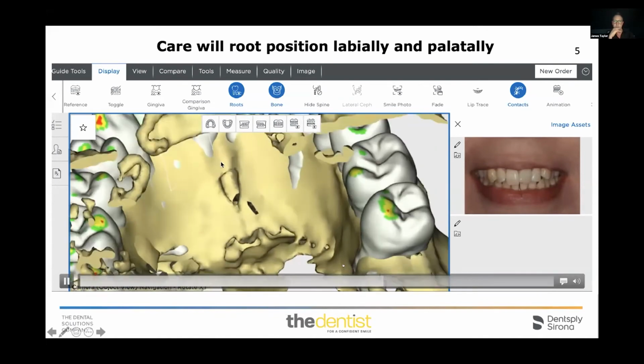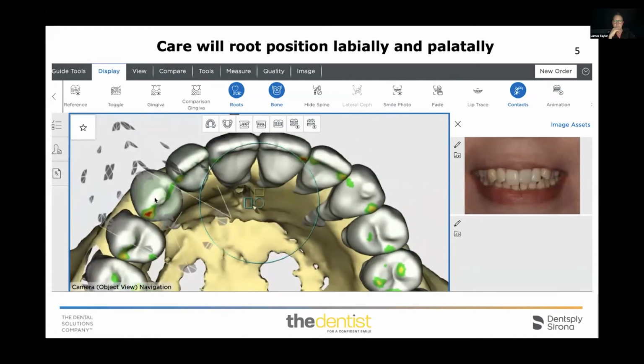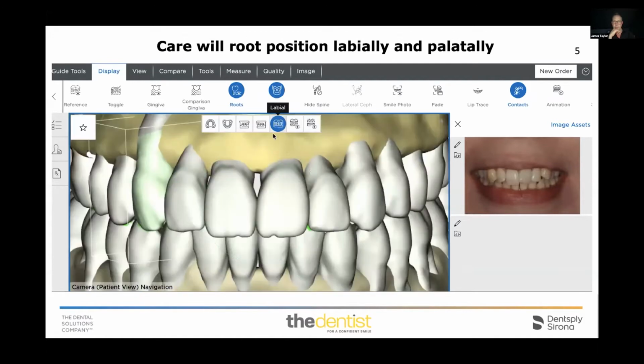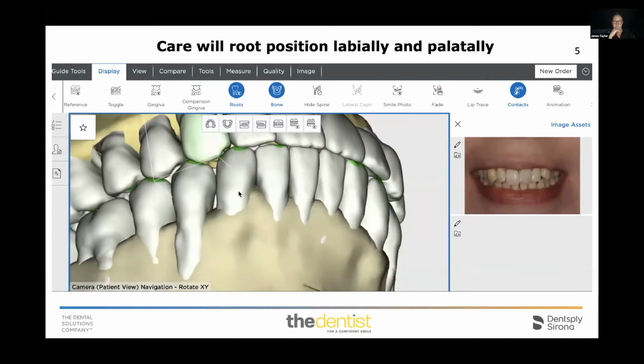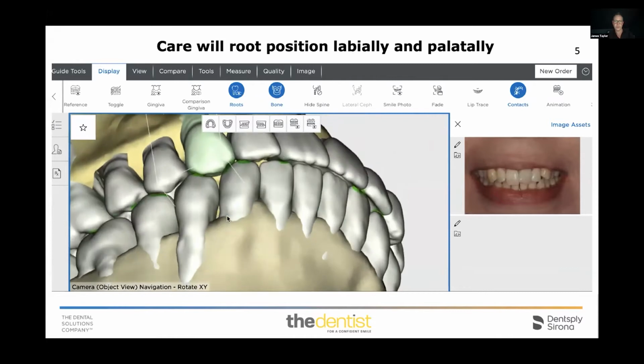And so we'll just finish off moving through this and see the changes I'm making to the teeth, just to improve the position of the teeth, to improve the occlusion, and just make sure that I'm not going to have any conflicts and any issues there as I finish off preparing the case prior to sending it back to Sure Smile for them to move towards finalizing and preparing the aligners for me.